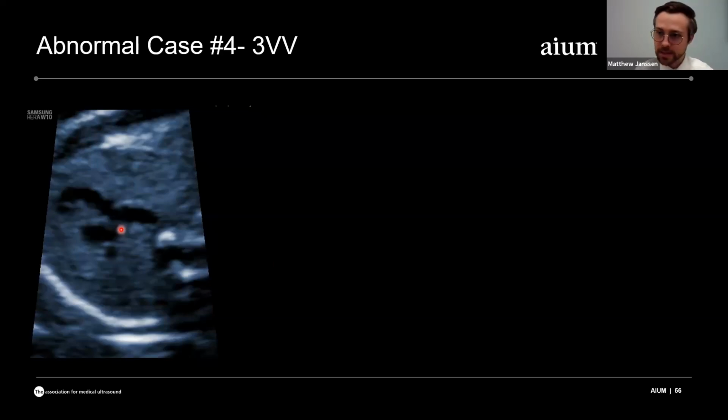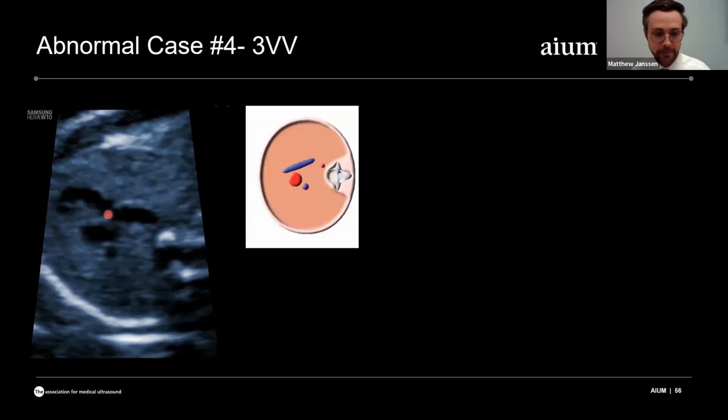We start analyzing the size between them and we say, well, if this is the pulmonary artery, that looks normal, but why is the aorta slightly larger than the pulmonary artery? These can be somewhat subtle differences in size. And that's another thing that we wanted to draw all of our attention to, just how subtle it can be that this dilation is more than the pulmonary artery. And so schematically, we can represent that like this.